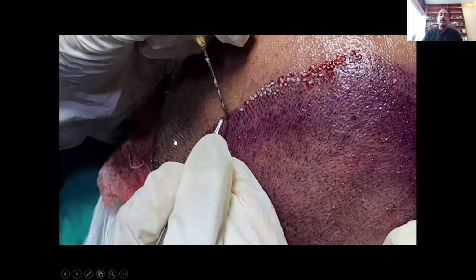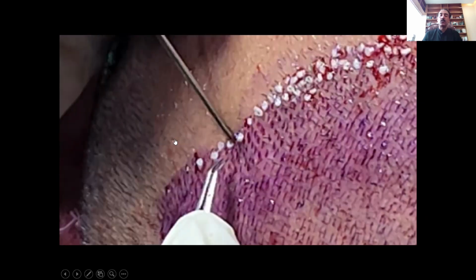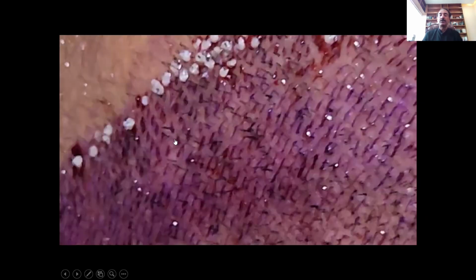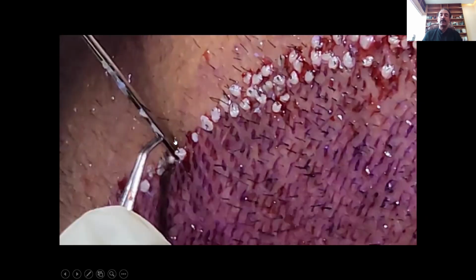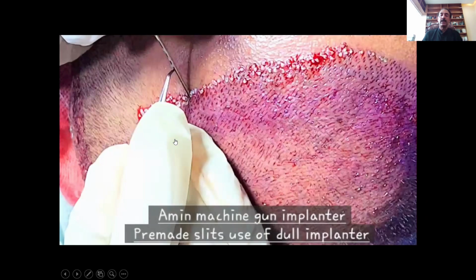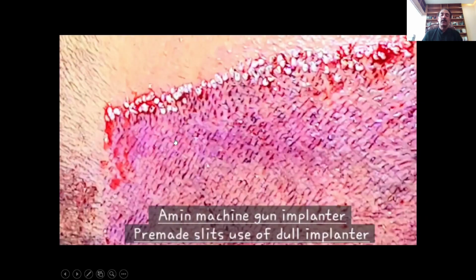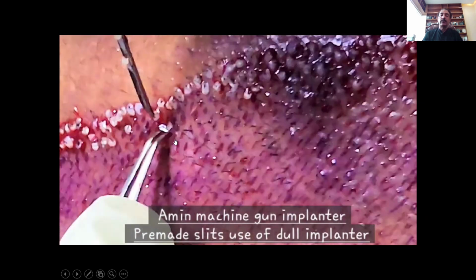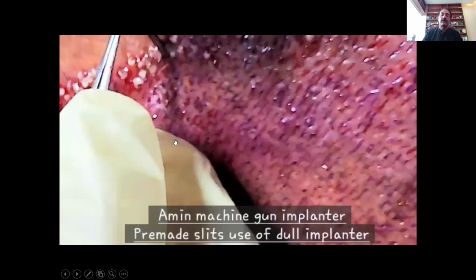You can use them in pre-made slits as well. If you like pre-made slits, you can make them. I usually use gentian violet to make my slits more clear and prominent. The slits I make with a 21 gauge needle, and then I use this 19 gauge implanter to feed the grafts in. You can see how easily these grafts are fed into the slits, and one tube can have 6 to 8 grafts, which can be implanted simultaneously. The grafts are protected and safe.